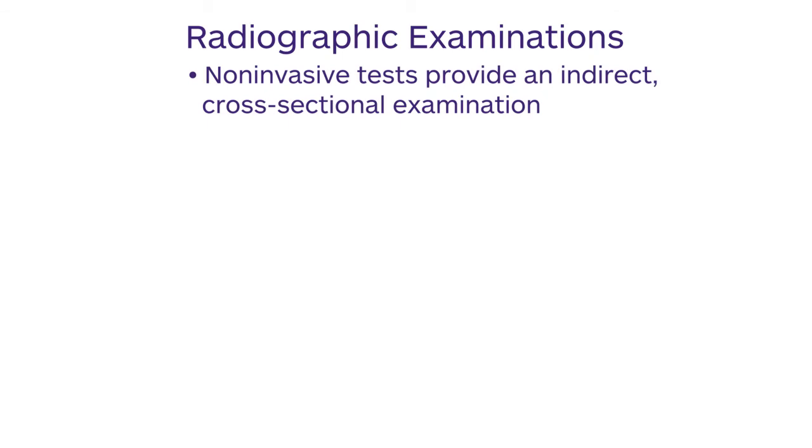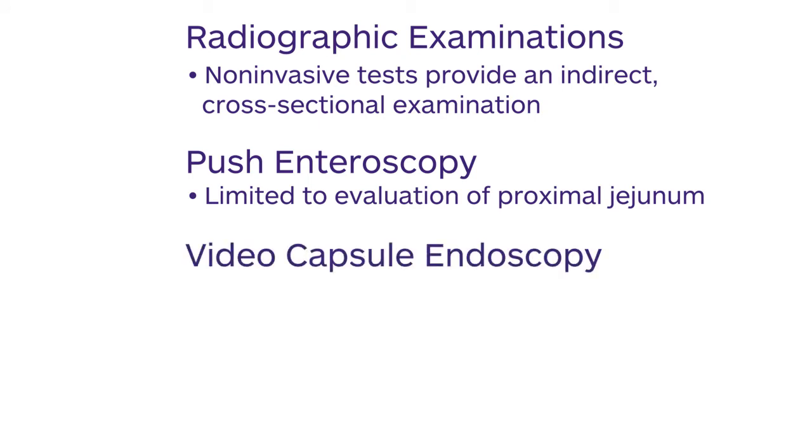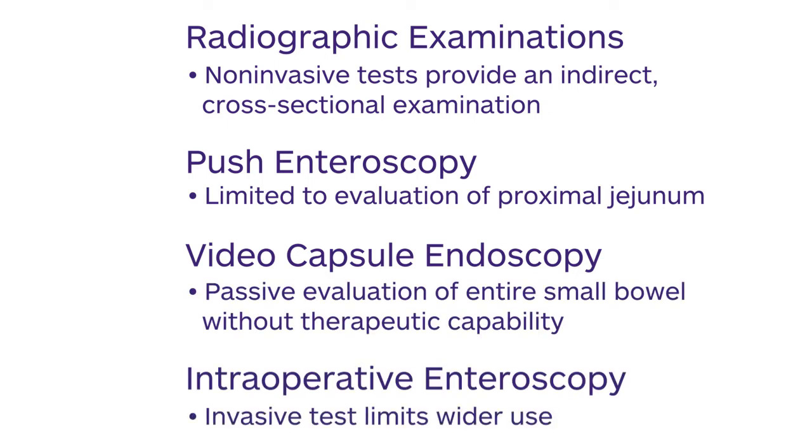Radiographic examinations, including fluoroscopic small bowel follow-through and enterography, are non-invasive, but provide an indirect cross-sectional examination. Push enteroscopy is limited to the evaluation of the proximal jejunum. Video capsule endoscopy can evaluate the entire small bowel, but only provides a passive evaluation without therapeutic capability. And the invasiveness of intraoperative enteroscopy limits its wider use.